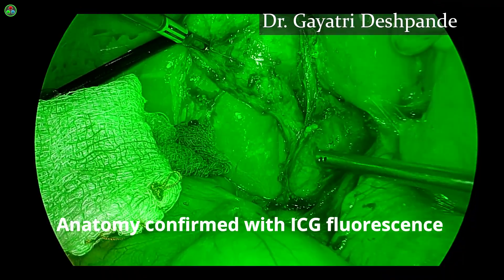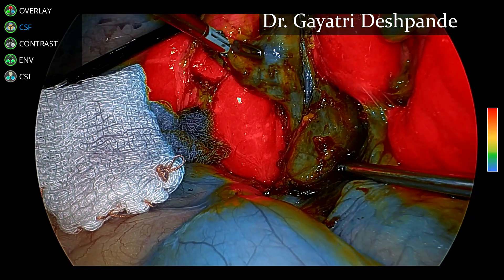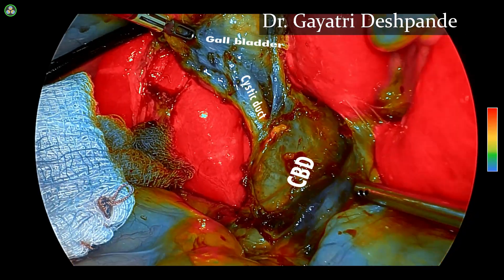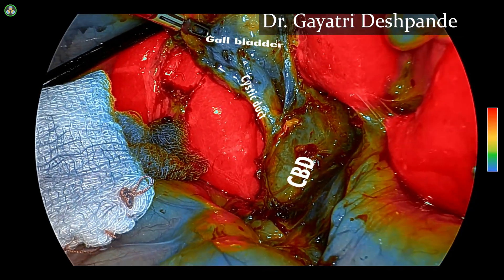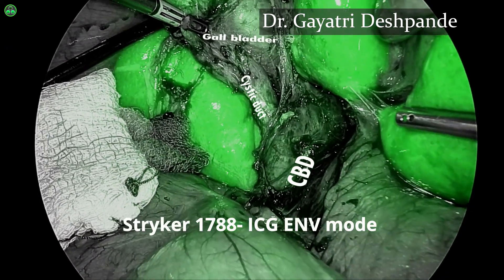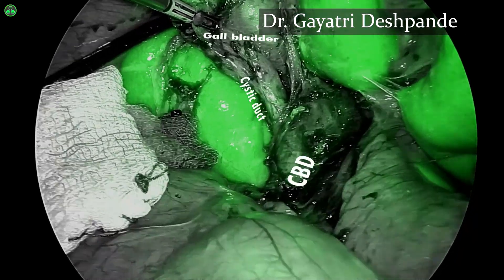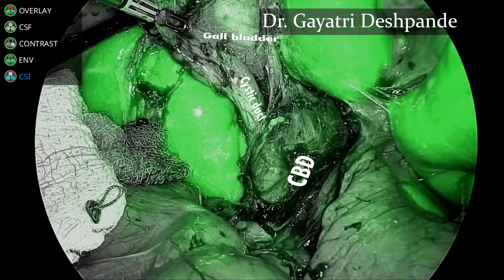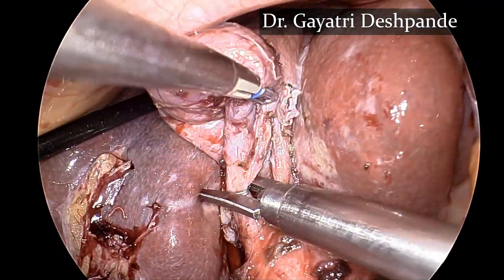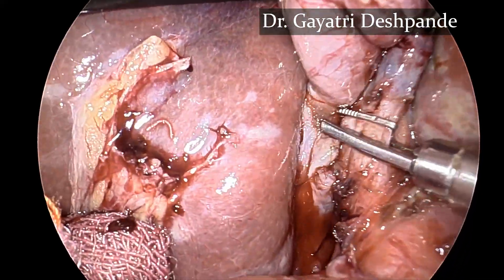The anatomy is confirmed using ICG fluorescence — the overlay mode, the CSF or color-segmented mode where the cystic duct and the CBD are clearly seen, the ENV mode, and the CSI mode of the 1788 system. These are very helpful in defining the anatomy. The cystic duct is now clipped.